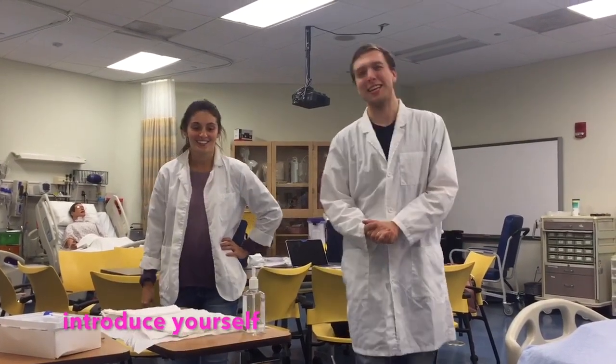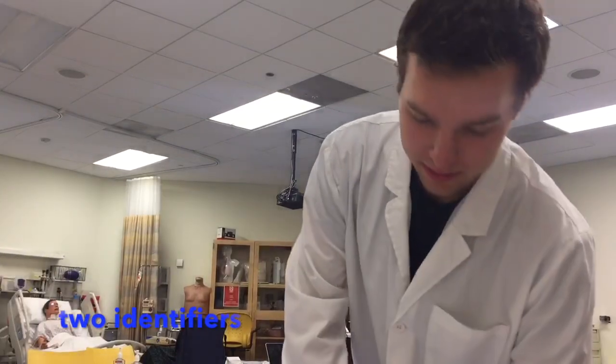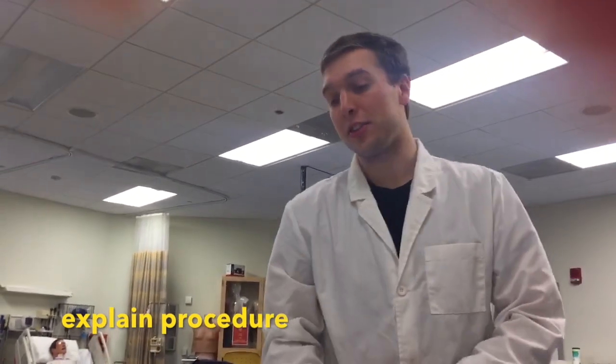Hi, my name is Jadon Tate. I'll be your student nurse today. I'm Anna. I'm going to be assisting him. May I go ahead and get your name and date of birth? All right, thank you very much. The doctor today has ordered a catheter to be put in for urinary retention.